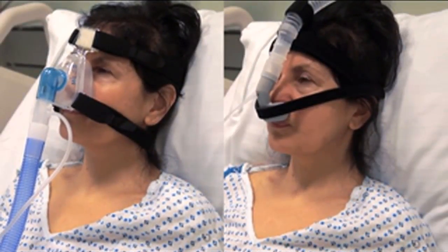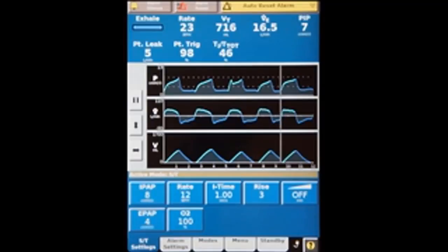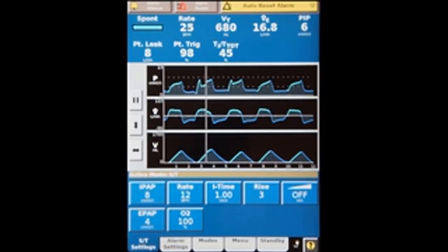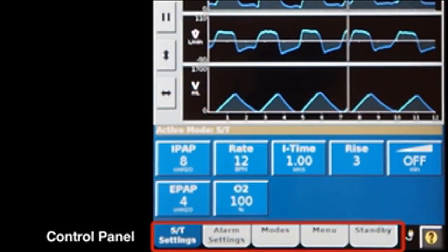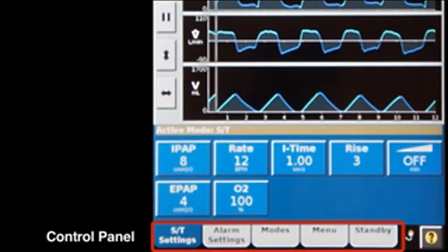Non-invasive ventilators for inpatients typically have a variety of modes, settings, and alarms. On this standard ventilator, the physician can toggle between ventilation settings, alarm settings, and ventilation modes by pressing the buttons at the bottom of the screen.